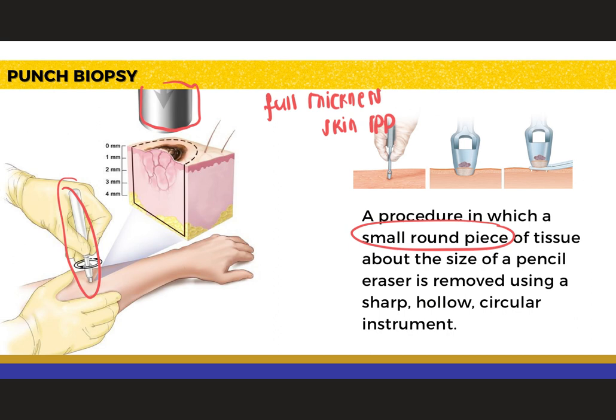So, pagka-push ninyo into the skin, you are going to rotate it down through the epidermis and dermis and into the subcutaneous fat, yielding a 3 to 4 millimeter cylindrical core of tissue sample. Again, we want to have a 3 to 4 millimeter cylindrical core of tissue sample.